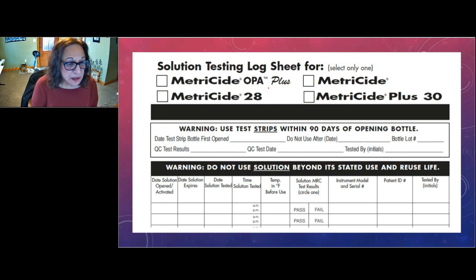Certainly you should be protecting your respiratory system as well as your eyes and gloves, and potentially a gown if there's potential for splashing. If you're pouring the jug into the basin, then definitely wear a gown. If you're rinsing the items after, I would definitely wear a gown or something to cover my scrubs to protect from splash, in addition to the other PPE. But as far as the N95, I've never seen that required or recommended by any of the manufacturers.